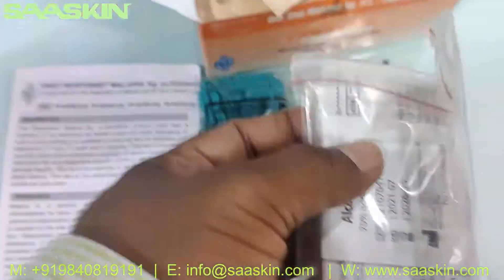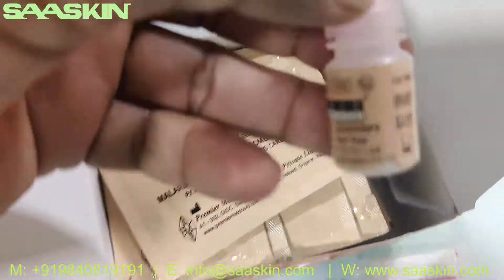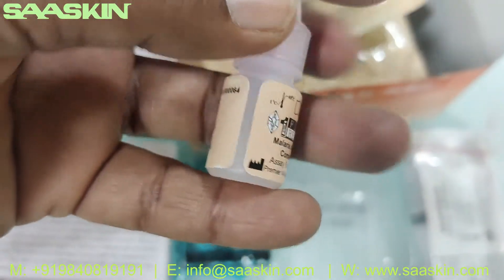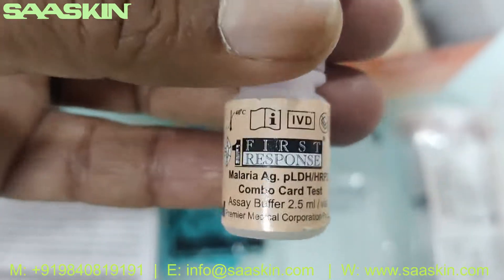You have 25 alcohol swabs and one buffer bottle. Here you can see the buffer bottle.